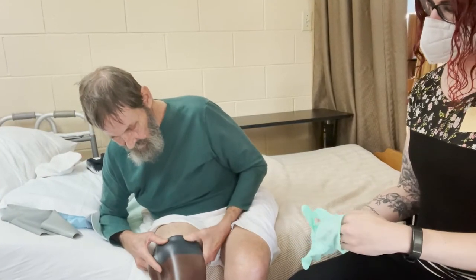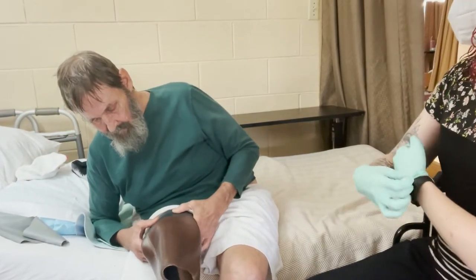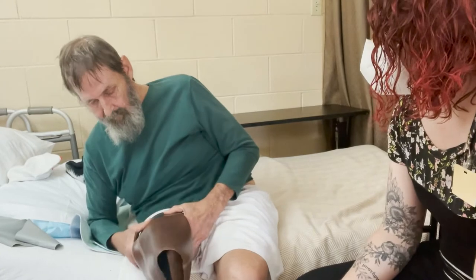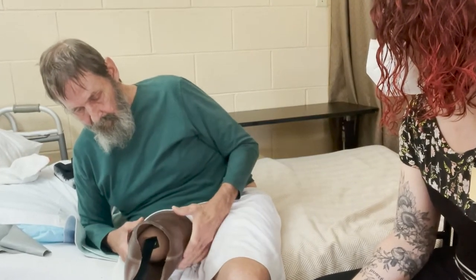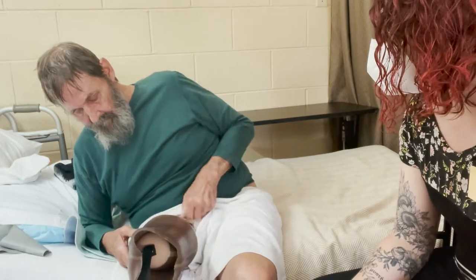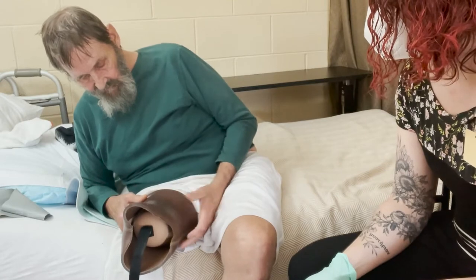Next, you see him using his palms to roll up the liner onto his limb. You want to make sure you don't pull the liner up, because that is going to put tension on the skin. Just use your palms to roll it up onto the limb.